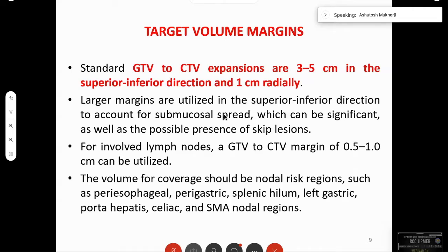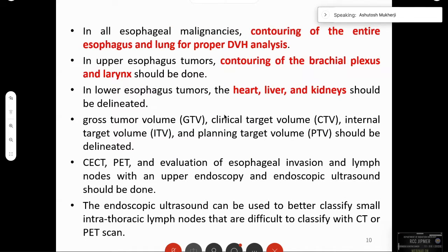In all esophagus cases it is better to contour the entire esophagus length and the lung for proper DVH analysis. In upper esophagus, the brachial plexus and the larynx should be contoured. In lower esophagus, the heart, liver, and kidneys should be delineated.